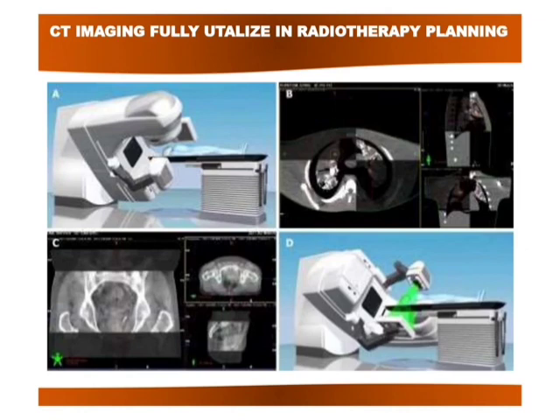Why is it so? Because the CT is the base. It gives you an accurate electron density for dose calculation purposes, so we combine with this. The CT is always there within the fusion images. One is CT images, the other may be a different thing.